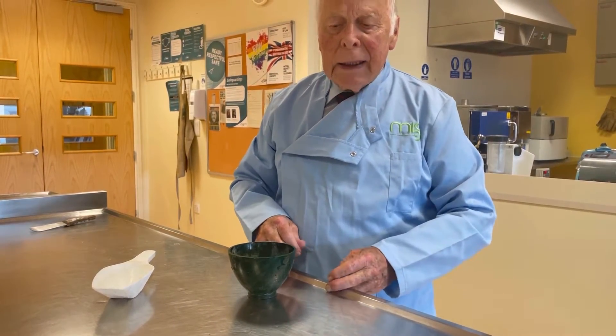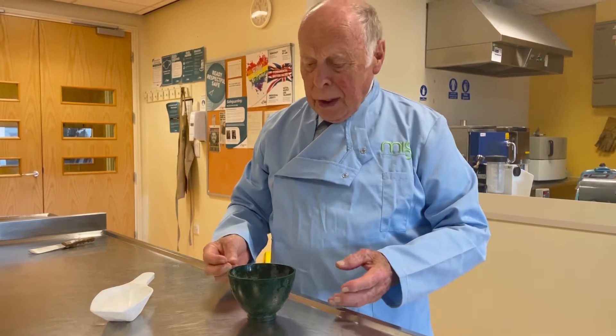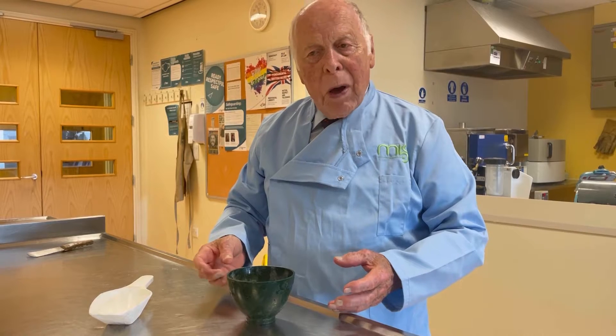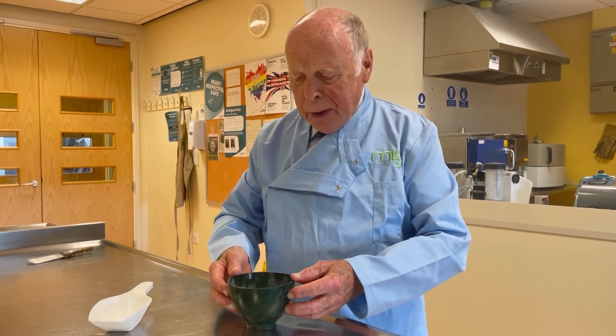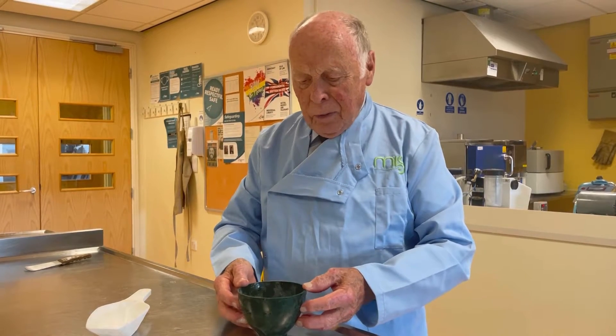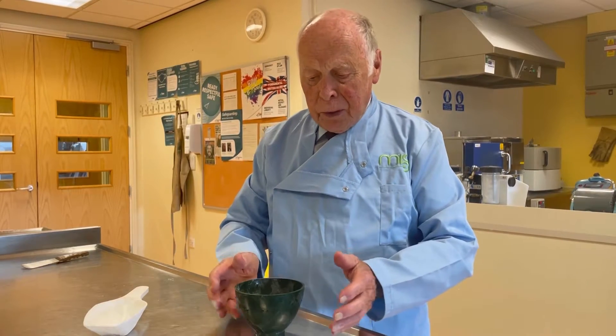I'm going to give you a demonstration of how to mix plaster without having to measure with a water measure or even a plaster measure. You can do it by eye. It's a thing that's been done for generations and you can learn it as easily as I'm going to show you.